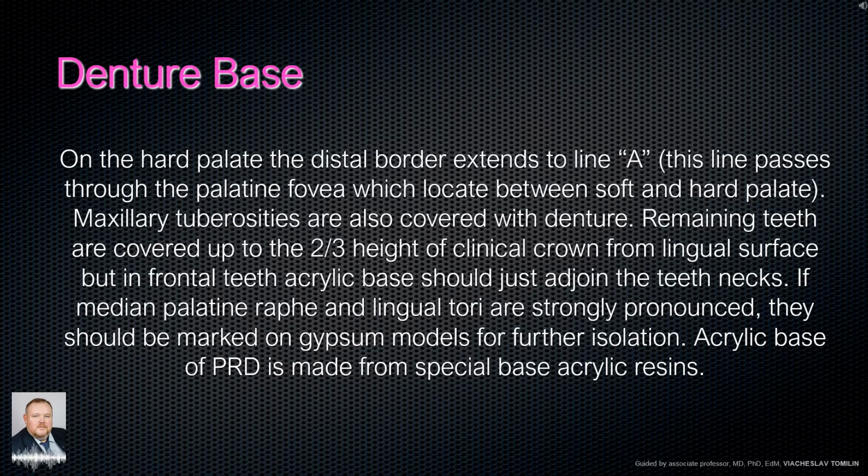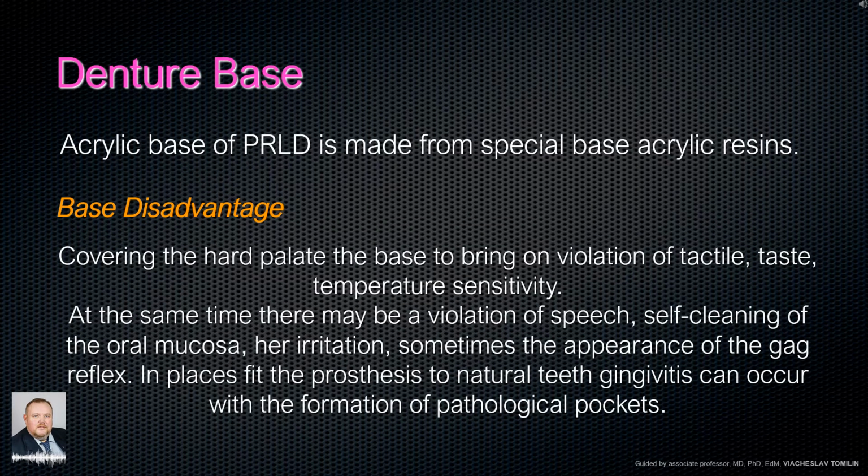Acrylic base of PRLD is made from special base acrylic resins.